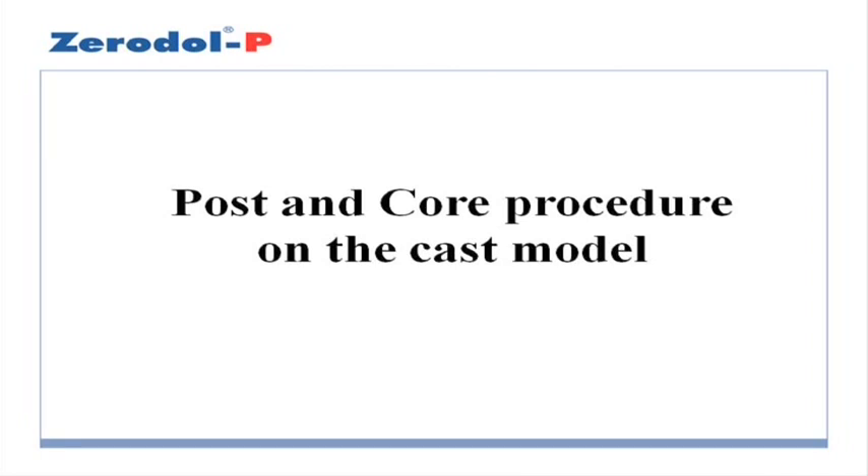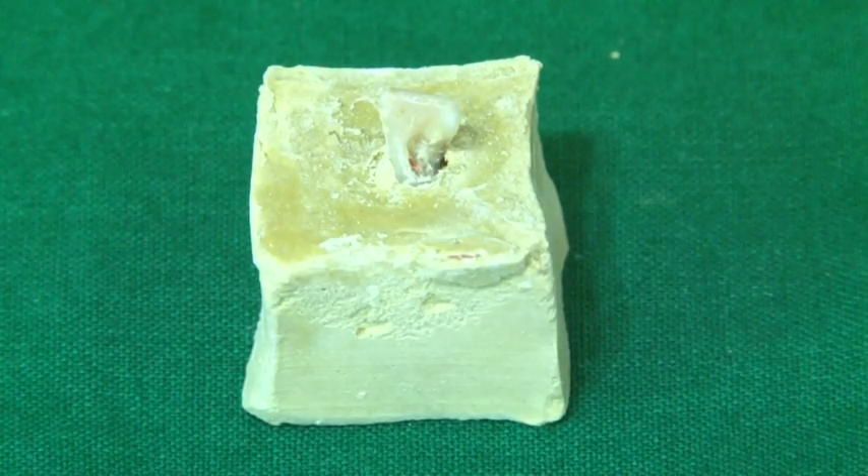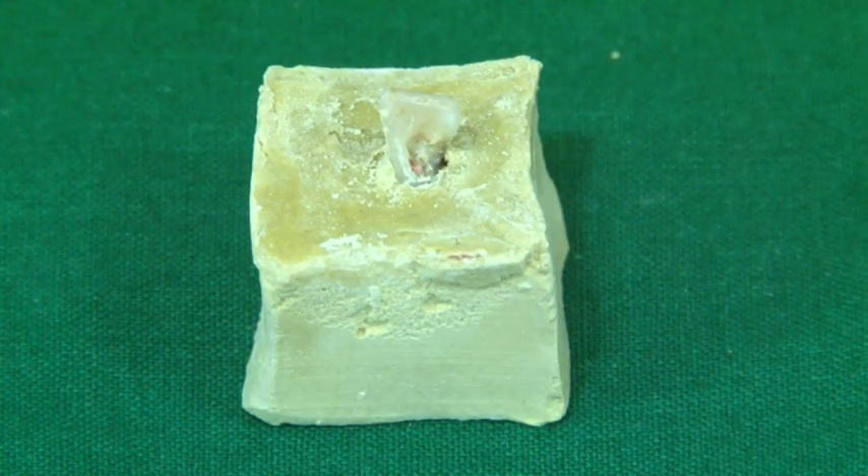Post and core procedure performed on the cast model or dummy. As you can see on this model, we have an endodontically treated lower central incisor. As you can see, there is no gutta percha in the coronal portion of the tooth.